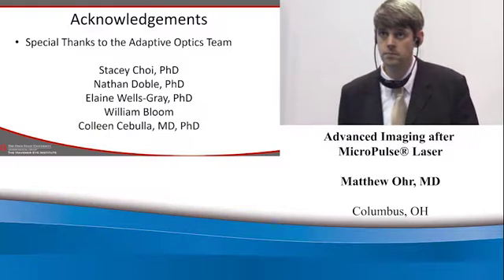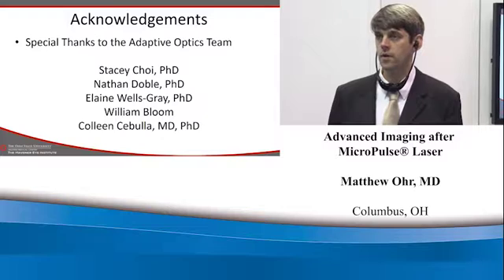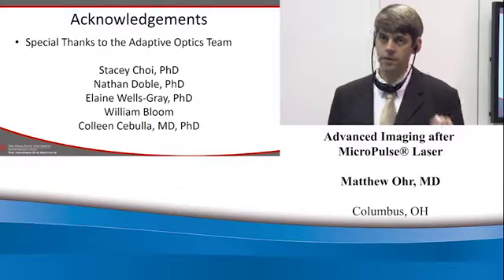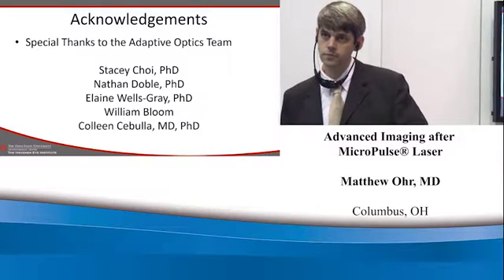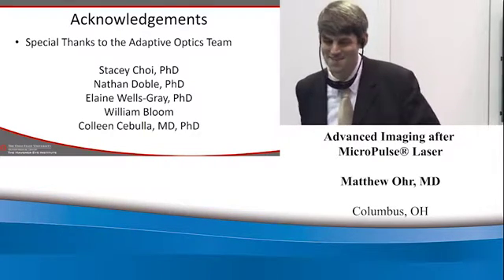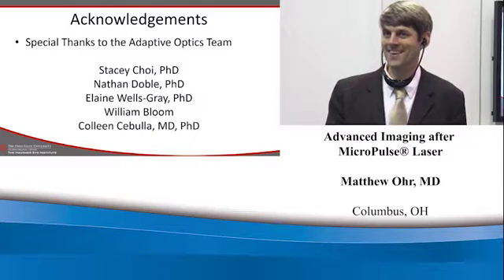On your patient, doctor, with the adaptive optics, what was the visual acuity before and then after in 2020? Okay, both in 2020. So that swelling went down, no photoreceptors, rods, cones, or anything were damaged, and you were still able to maintain the 20/20 vision. Correct. How many other patients have you imaged with this technology, and what are you seeing? Or my basic science researchers are going to kill me. We have about 4 right now that we're looking at.